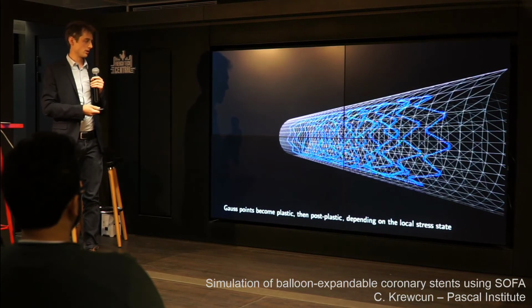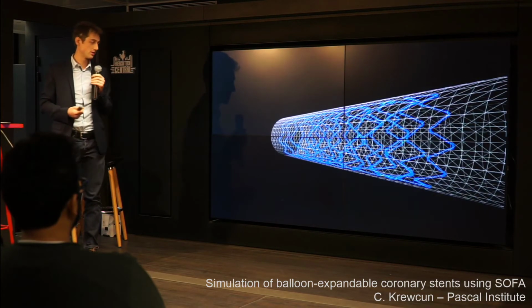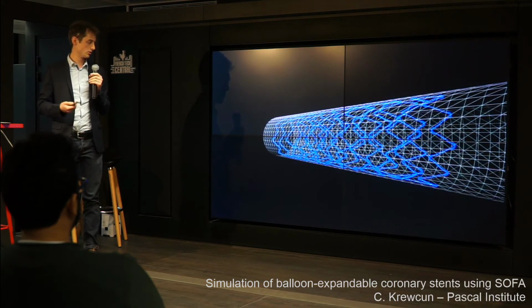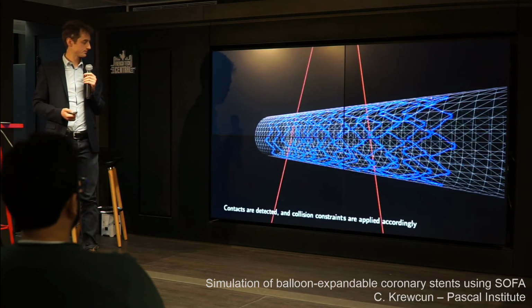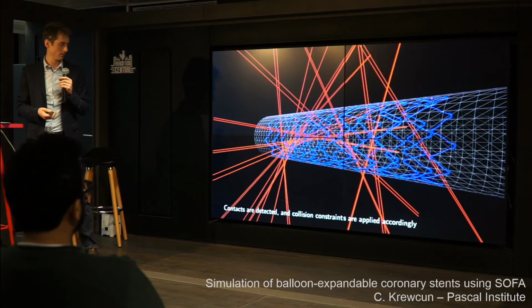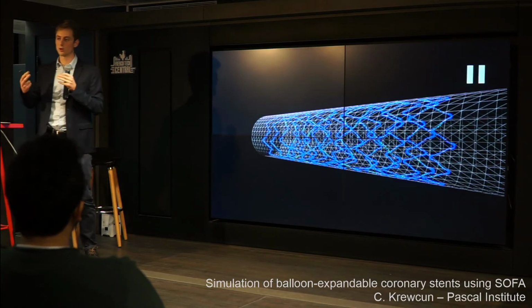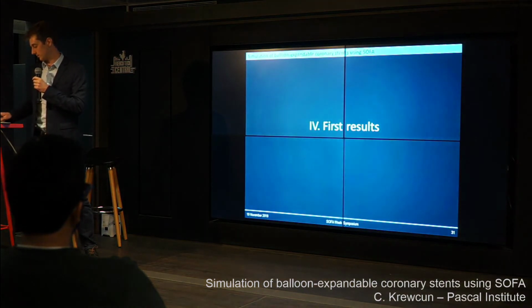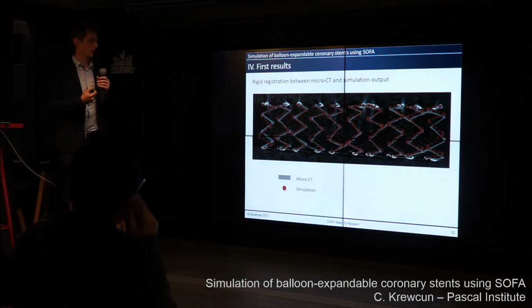At some point, the stent is put in contact with the artery wall, which is also modeled, and which is elastic in this case. When this happens, contacts are detected and resolved thanks to the classic collision pipeline of SOFA. Here were the directions corresponding to these constraints, and I stopped displaying them because, of course, all the nodes of the stent are eventually put in contact with the artery wall.